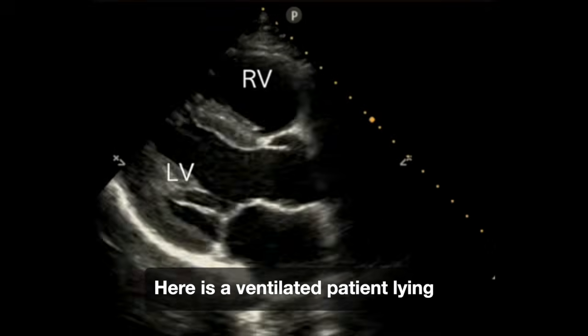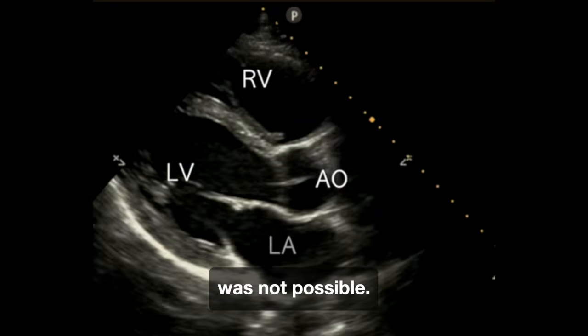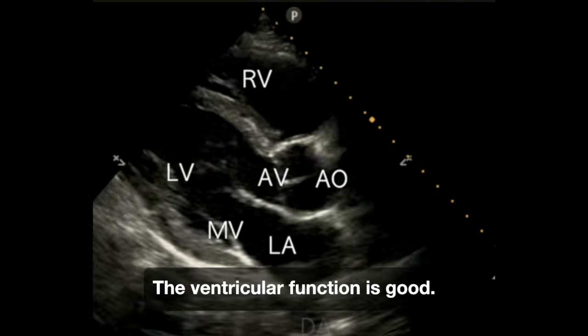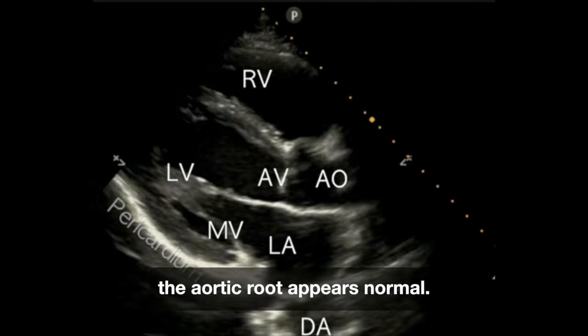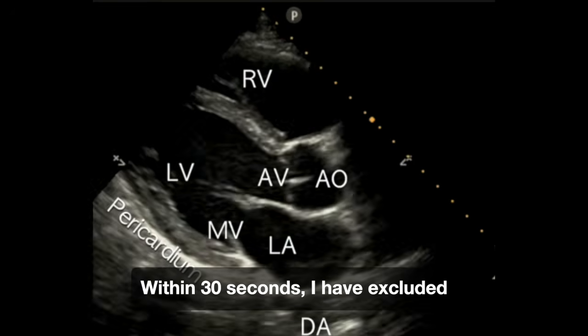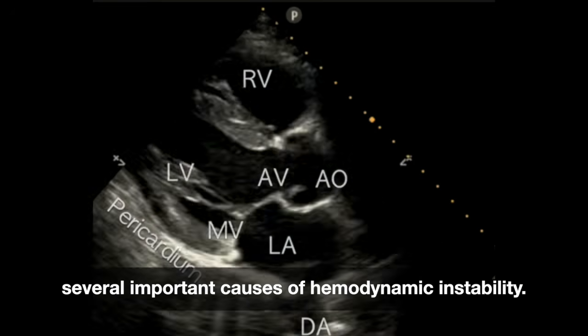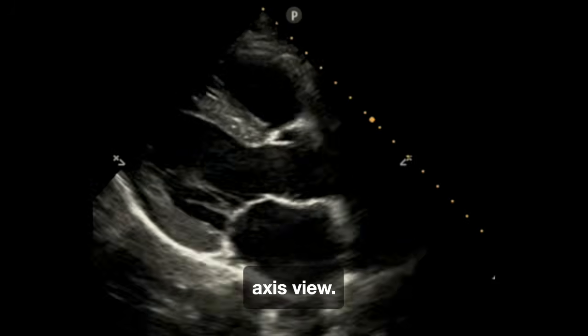Here is a ventilated patient lying supine in whom leftward tilt was not possible. The chamber sizes are normal. The ventricular function is good. There is no pericardial effusion and the aortic root appears normal. Within 30 seconds, I have excluded several important causes of hemodynamic instability. That is the parasternal long axis view.